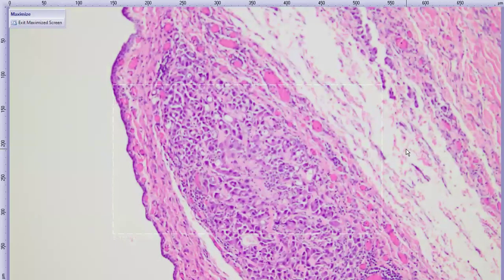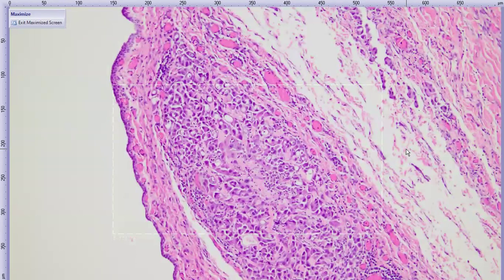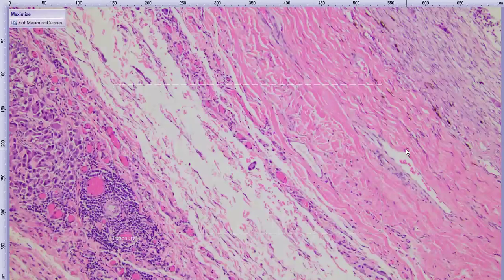There was also the low intraocular pressure, which is often associated with uveitis, but low intraocular pressure is caused by anything that reduces the amount of aqueous production by the ciliary body or increases the rate of loss of aqueous, like a rupture where some is leaking out. In this case, probably the destruction of the ciliary body by the neoplastic cells was more likely the cause of hypotonia. And then, of course, another confounding factor is that there is inflammation around these neoplastic cells.